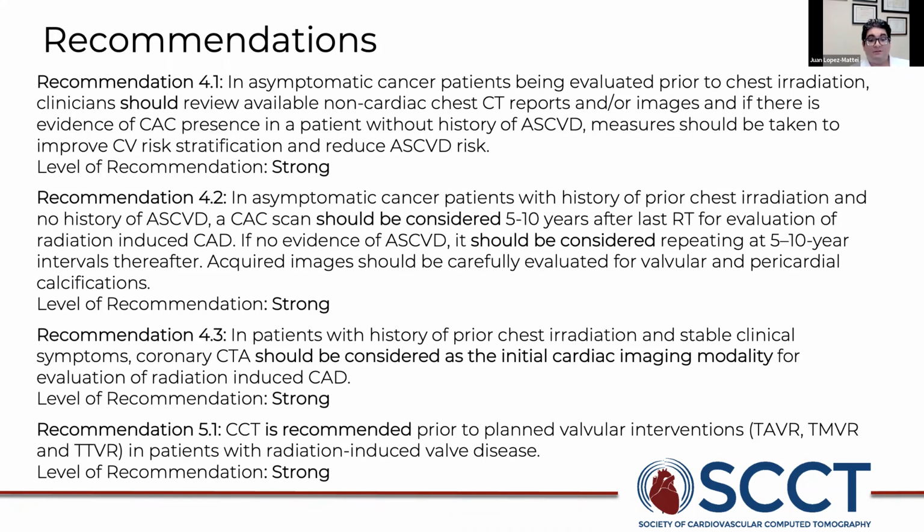Recommendation 4.3: in patients with history of prior chest irradiation and stable clinical symptoms, coronary CTA should be considered as the initial cardiac imaging modality for evaluation of radiation-induced CAD. Level of recommendation strong. Recommendation 5.1: CCT is recommended prior to planned valvular intervention in patients with radiation-induced valve disease, and this level of recommendation is strong.